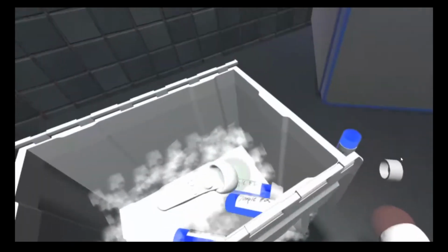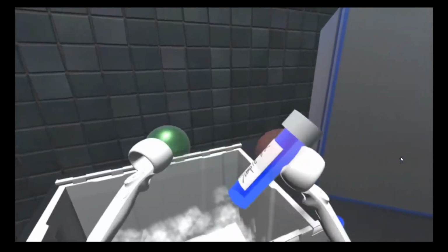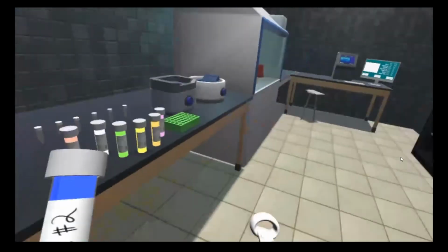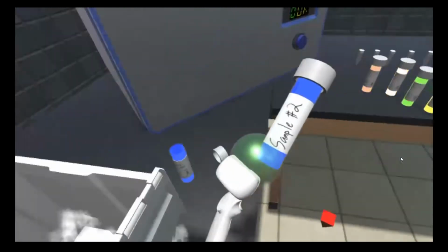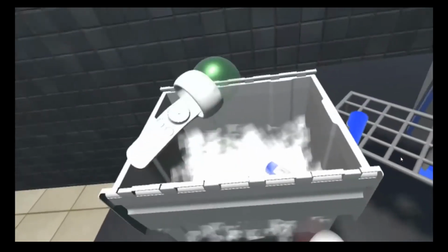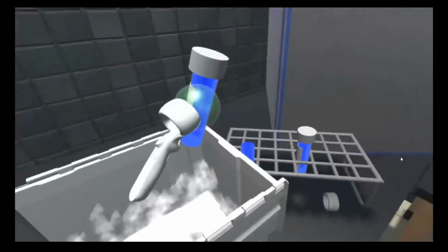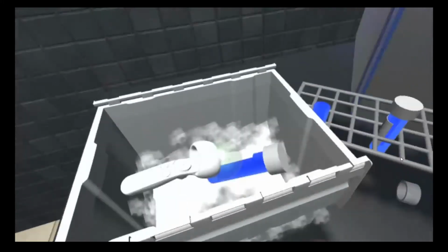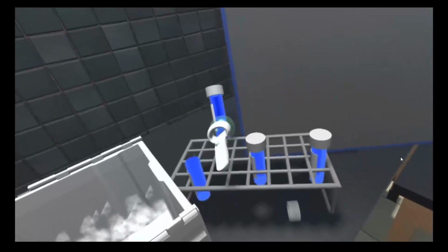As the novel coronavirus continues to affect people worldwide, understanding how to detect infection is important to not just medical professionals, but those with an interest in biomedicine. Using a recreation of a real-world functioning laboratory, we have constructed a simulation of COVID-19 PCR testing, complete with the proper tools, equipment, and reactants necessary for a successful diagnosis.